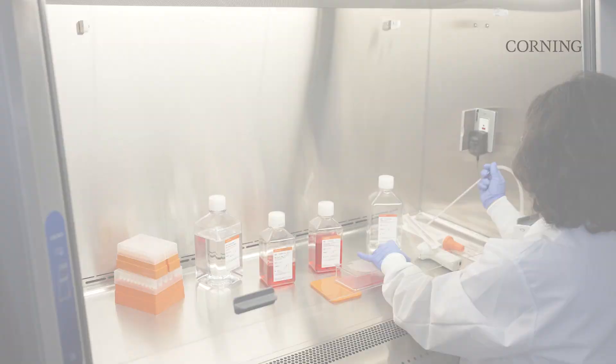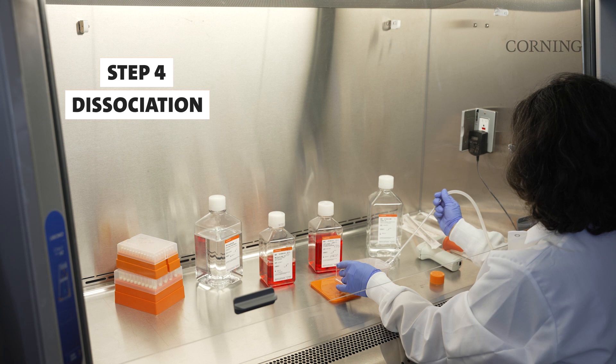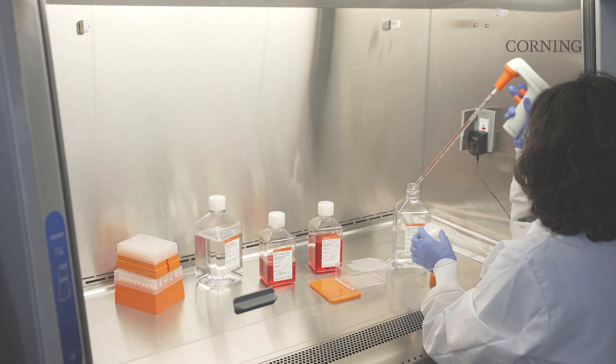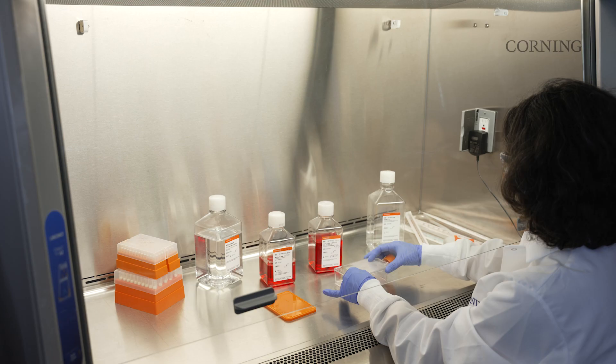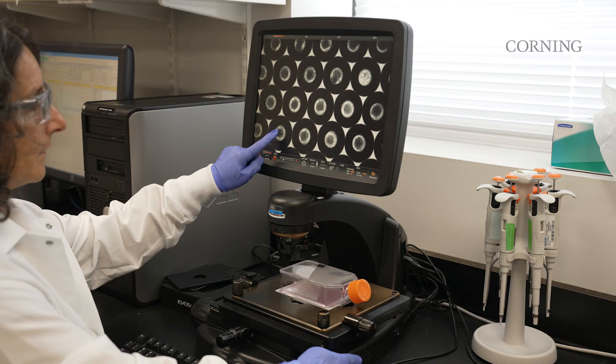Depending on downstream requirements, spheroids can also be dissociated into single cells directly in the vessel. To dissociate the cells, remove spent medium and perform a 1x PBS rinse. Add 5 to 10 milliliters of the desired dissociation reagent and allow liquid to fully distribute across the surface by swirling the flask lightly. Incubate the spheroid cultures according to the dissociation reagent protocol for spheroid culture. Spheroids will appear larger and will lose their shape once they are ready for dissociation.